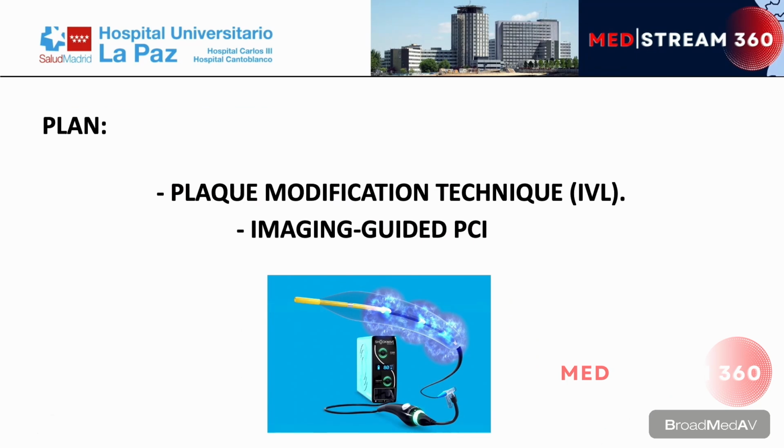So we are going to do a percutaneous revascularization of the anterior descending artery using lithotripsy to obtain the best result in the calcified lesion, and we are going to guide the procedure with an imaging technique, which is OCT.